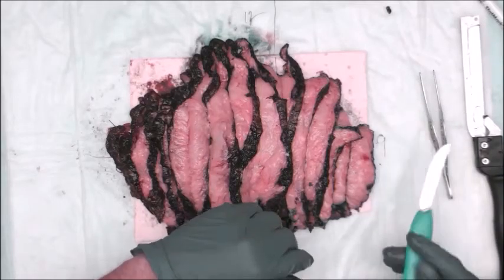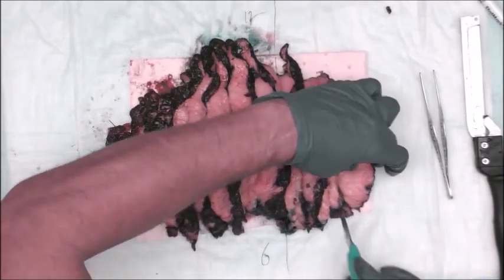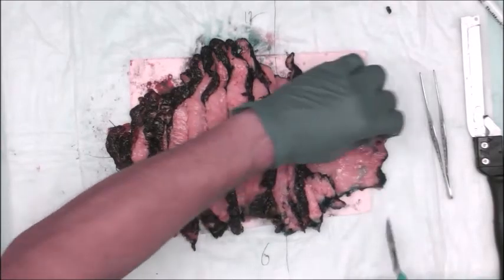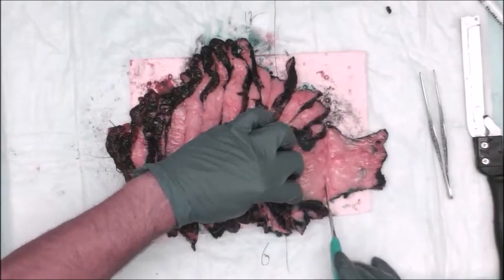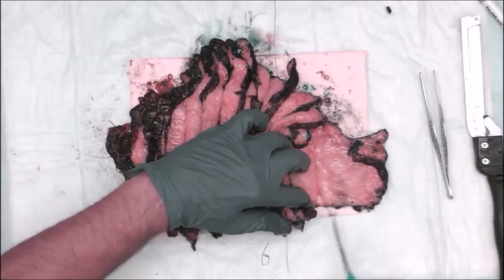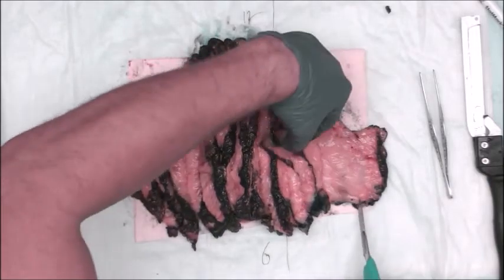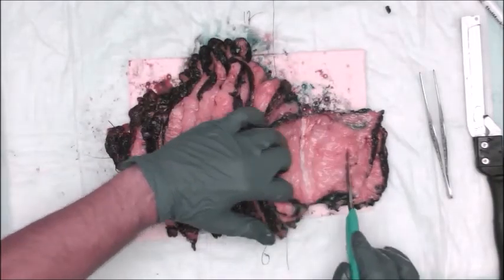So now that I've done the bread loafing, I like to go back a second time and make sure I've got cuts all the way through the breast parenchymal side at the periphery, like right here at the periphery. Sometimes when you initially cut this, you don't get all the way down far enough.